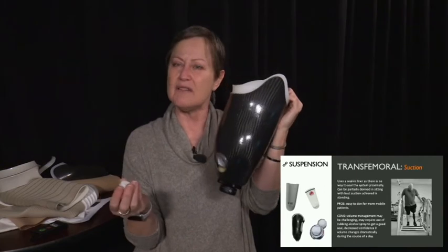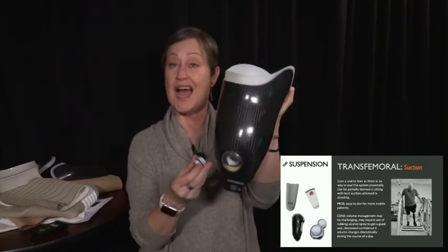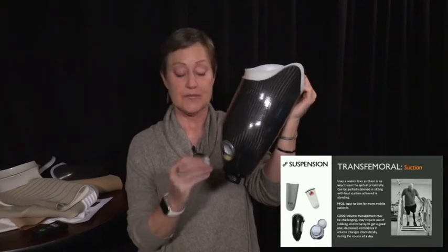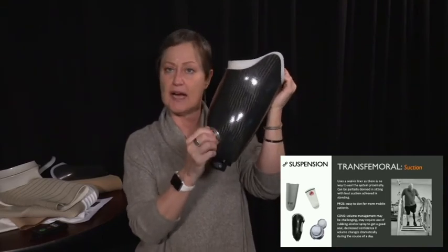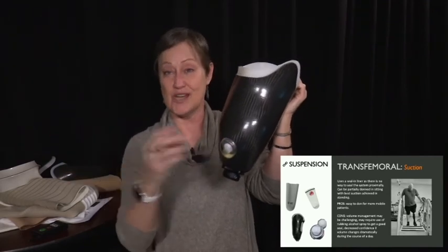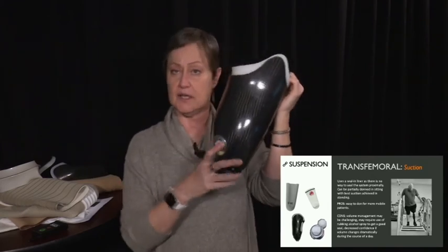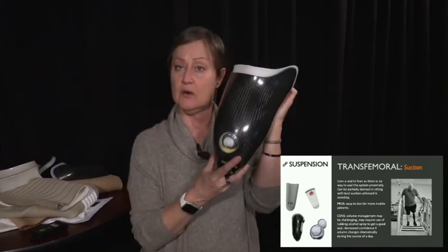This is early in their rehab when they're learning what it should feel like to have the socket donned correctly. Then they put the valve back on. Now they have to reestablish suction. When you take the valve out, you lose your suction. Put the valve back in, put some body weight on, release, and you're good to go.